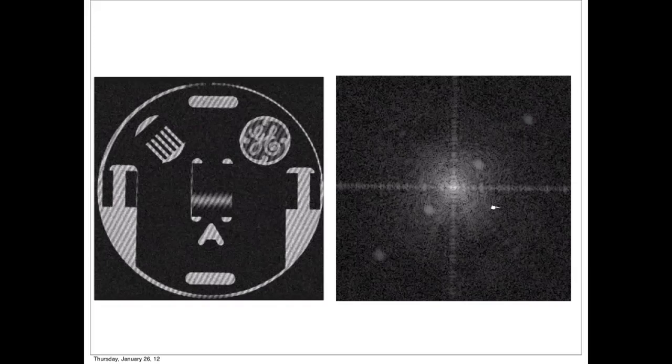Well, the reason is the following. If I have a complex harmonic, I have a real part and I have an imaginary part. And if I look at the magnitude of that, it would be constant. When I display an image, normally, I set black to be some value and I set white to be some value. So often, even though you have some background, you might set this offset to be black. And this is why this is dark.